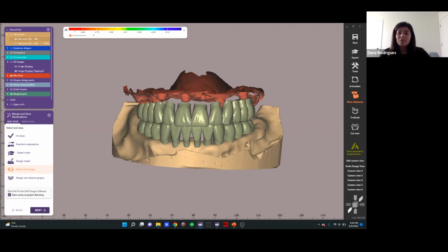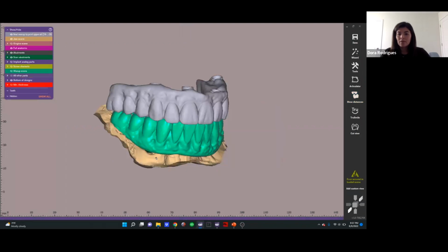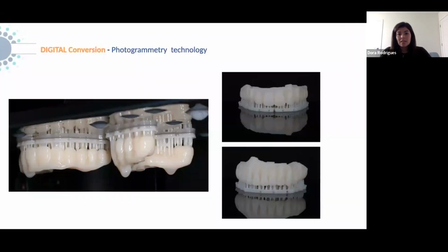And basically, I just redesign my gingiva on my new model and then attach the holes, redesign, and then send it to the printer. In this case, I did a little bit of cutback on the gingiva. This is the Smile Ultra Plus Flexera on the Einstein. This is 25 minutes printing.